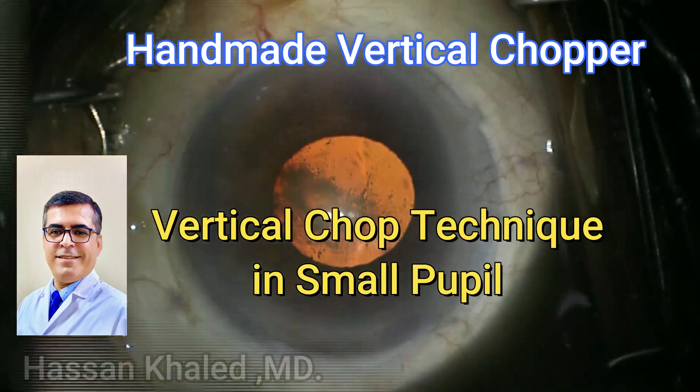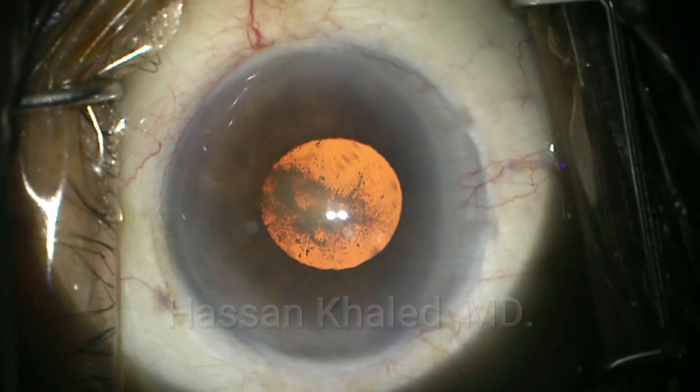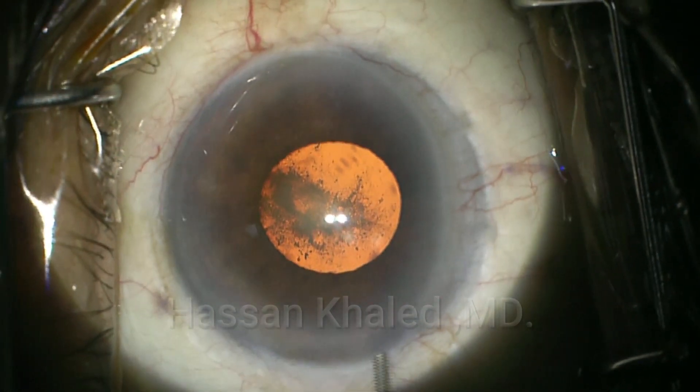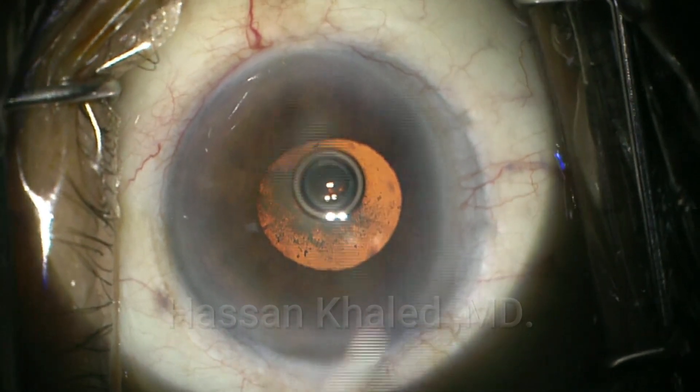Here is a case of phaco emulsification of a moderate dense cataract with a small pupil. In this case, I'm going to show you how to make your own cheap vertical chopper.